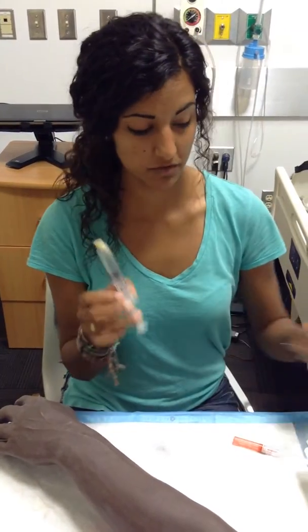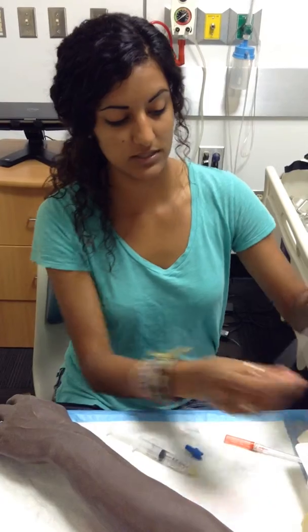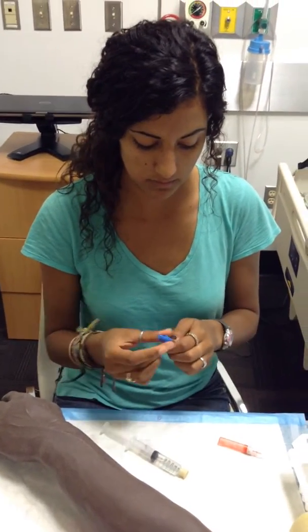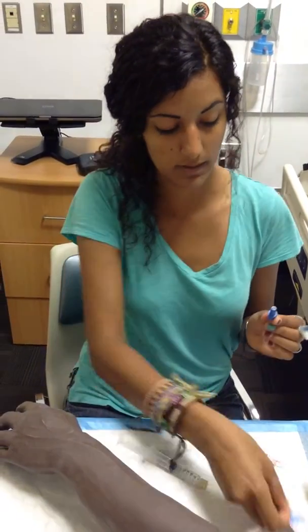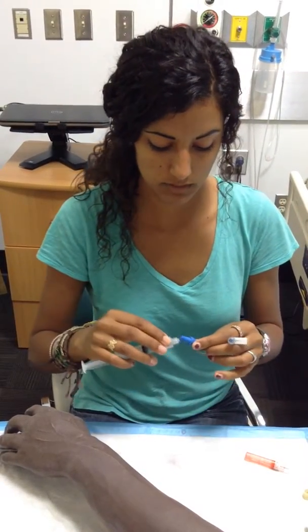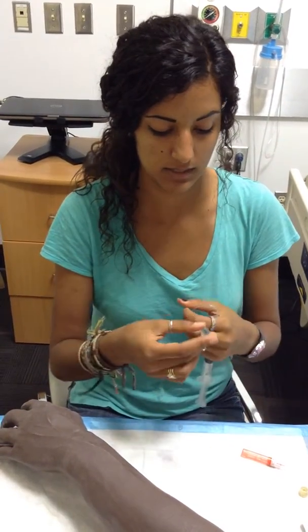I have the syringe of normal saline. I have the lock device and the tubing. So making sure that this all stays sterile, I'm going to connect the lock device to the tubing, sterilize the hub, connect it to the syringe, like so, and then put that to the side so I can use it when it is time.